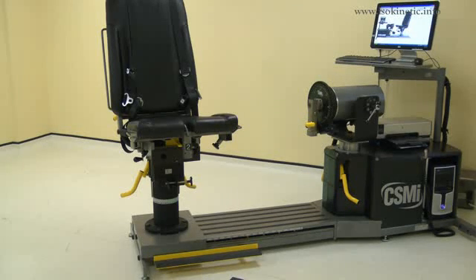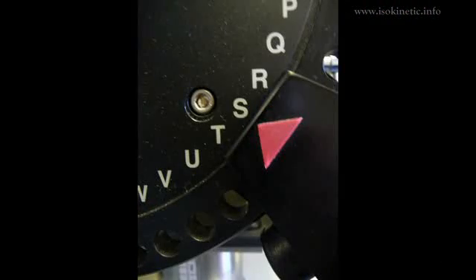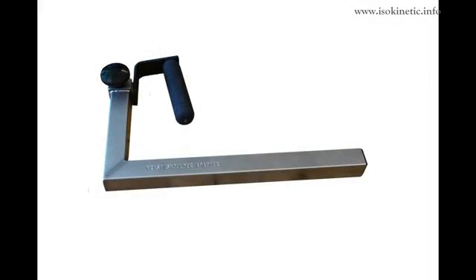First ensure all of the adapters and stabilizers are removed. Move the first dynamometer stop to position S on the wide scale. Now move the second stop to position P on the green scale. Now collect the adapters and stabilizers for this position.